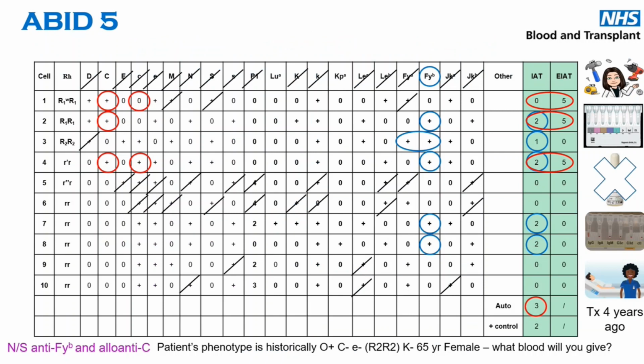So do more exclusions. Moving on down, that one's gone. On your next one, that one's gone, but you have only excluded it once. Again, I would probably be inclined to put up another cell, just because I'm a bit obsessed by Kidd antibodies. So it's looking here like we've got a Duffy b, and again you can see there that this has shown dosage, and you've got that weaker reaction, in a similar way to your Ms and your Kidds.